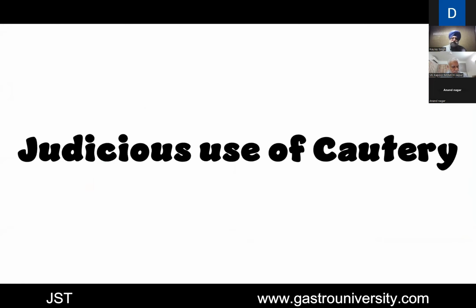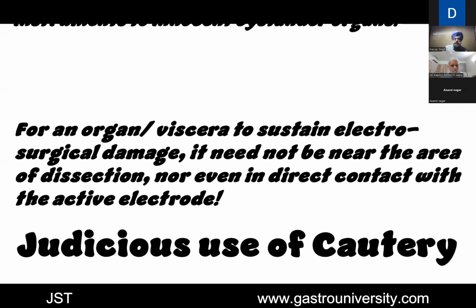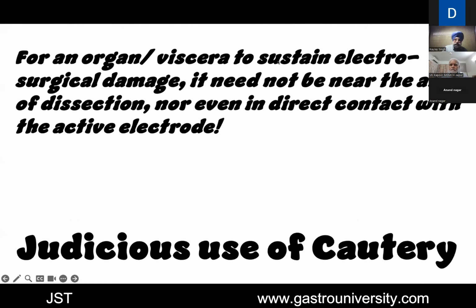So a lot of people say there's judicious use of cautery. At times I wonder whether there can ever be a judicious use of cautery. Because the current not only travels through physical contact, but it jumps. It is very important to know that the current is not going in a straight line. It jumps from one place to another, and even from sealed parts of active instruments to other organs, which are not necessarily near the area of dissection, but placed much farther away from the active electrode.